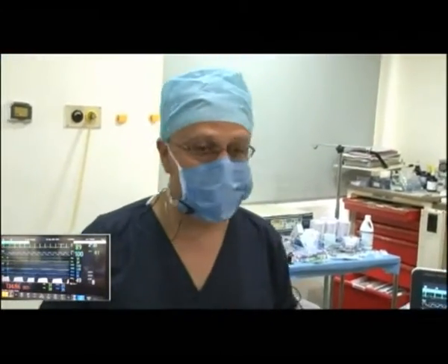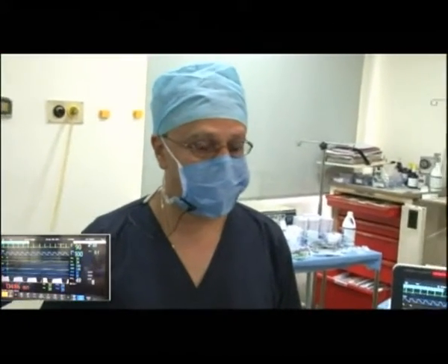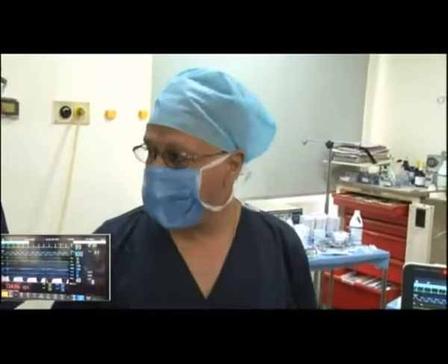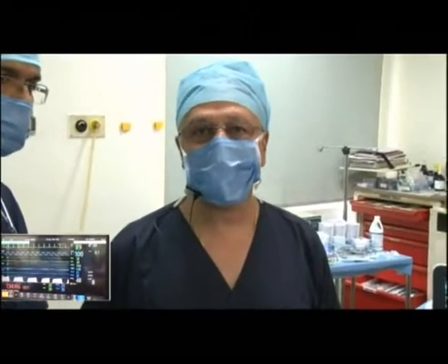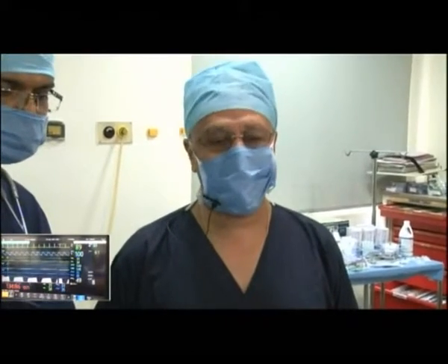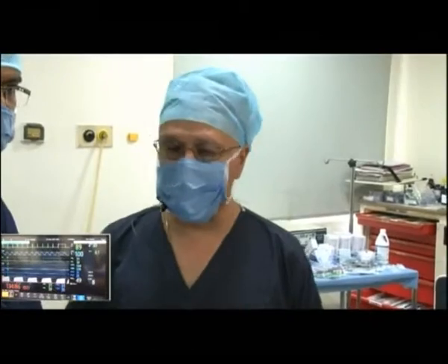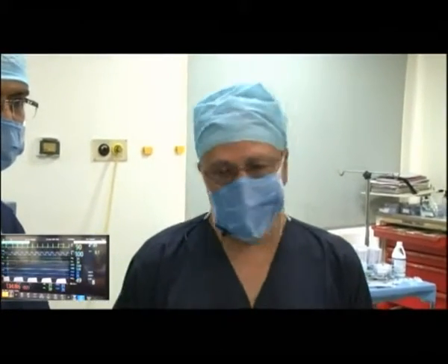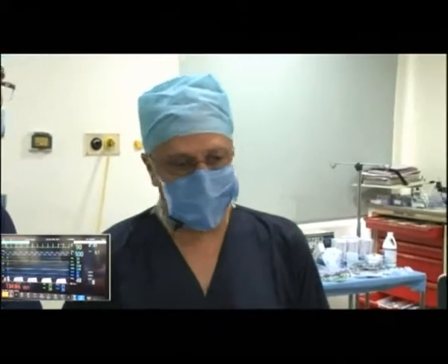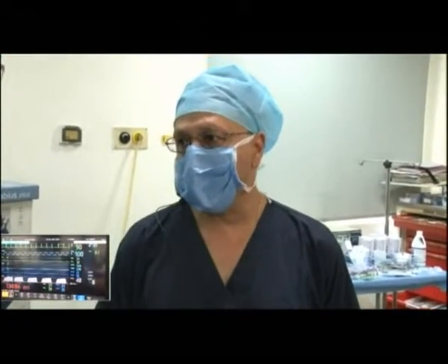Hello, sir. It looks quite advanced. You've used the BIS monitor. You've used desflurane. It's a short procedure. Couldn't you have done away with an LMA rather than an endotracheal intubation? Correct. That's why when I got started off, in fact, there were two ways. This is a very short procedure, as you say. We could have just held a mask, not even an LMA.